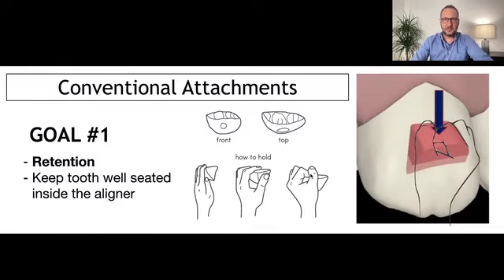The attachment here works the same way as the climbing wall. Imagine the hand that needs a surface so our fingers can create a good hook there, so we can put force to climb. It's exactly the same. By understanding this, we need to understand that the bigger surface needs to face against the center, the direction of the force.